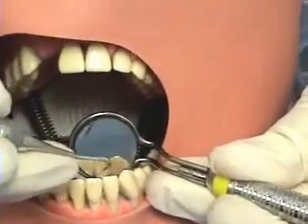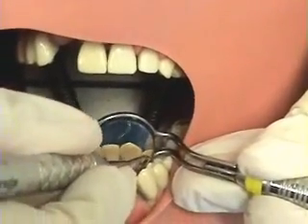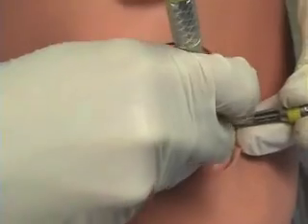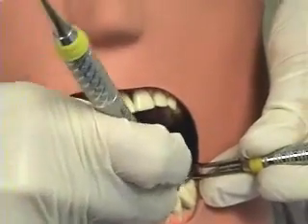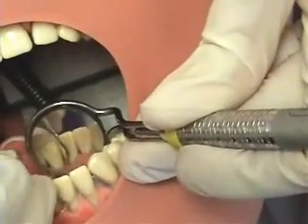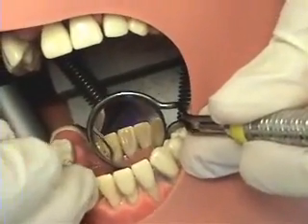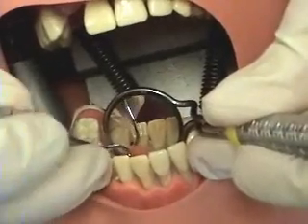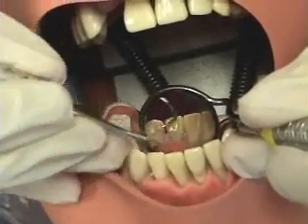Anterior teeth are divided into surfaces away and towards. I was working surfaces away from an operator 11 o'clock position for a right-handed clinician. For surfaces towards me as a right-handed operator, I can choose to stay at this position or move down to the 7 or 8 o'clock position. Notice how controlled the strokes are. Uncontrolled strokes can result in tissue laceration, trauma to the patient, or getting the instrument caught in the contact.